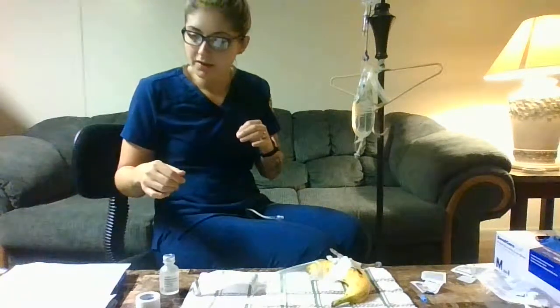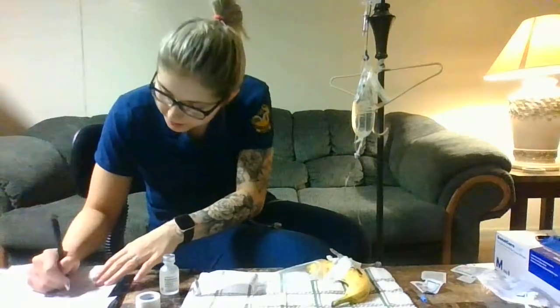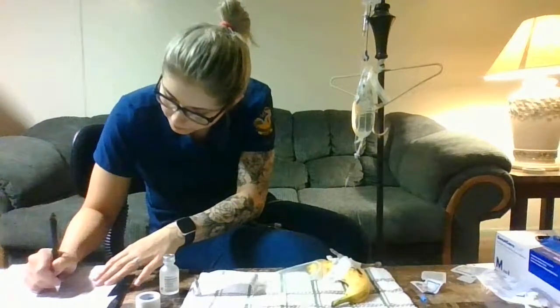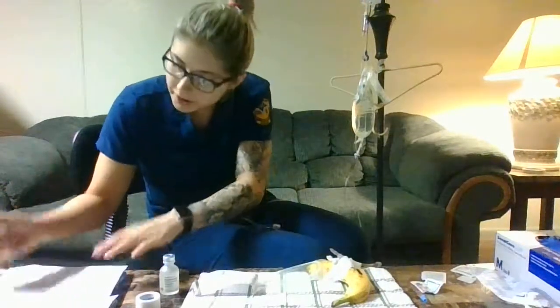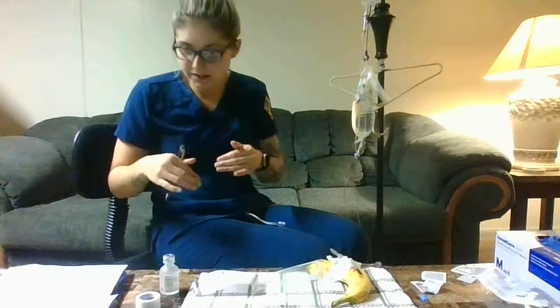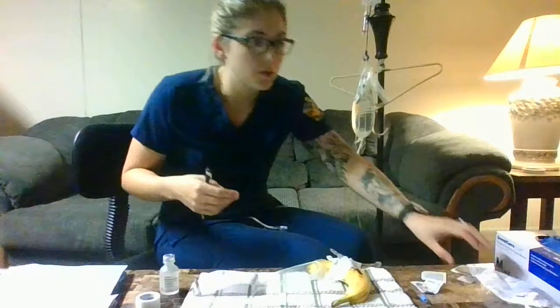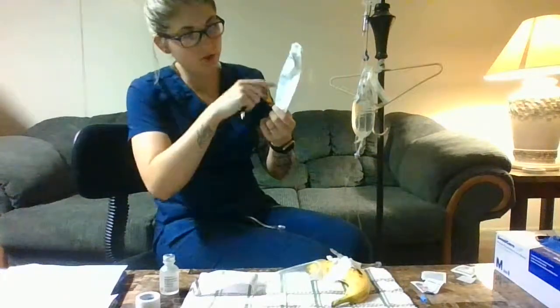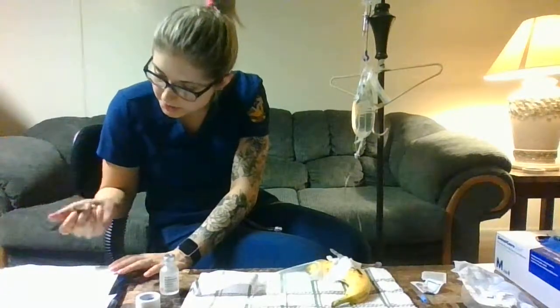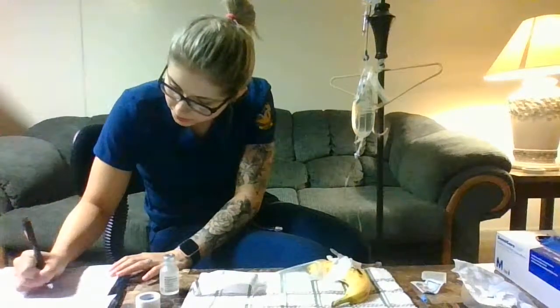So when you do the math, it goes up to 67 drops per hour. Or sorry, 67 milliliters per hour. You divide 67 by 60, and that gives you 1.1. And you times that by your drop factor, which was 10, as it states on the secondary medication set wrapper. So 1.11 times 10 equals 11 drops per minute.